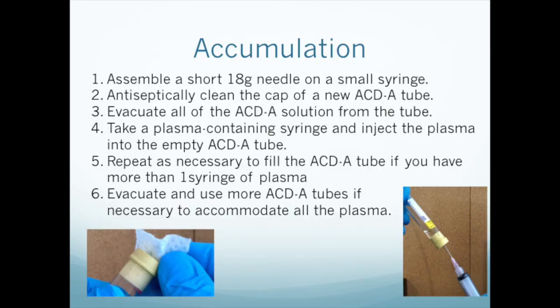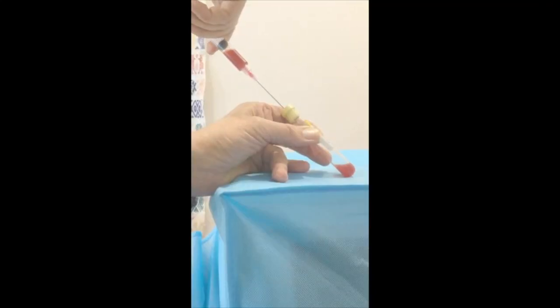Antiseptically clean the cap of a new empty ACDA tube. Assemble the 1-inch 18-gauge needle on a small syringe, then introduce the needle through the cap of the ACDA tube and withdraw all of the ACDA solution. Discard it. Now take the syringe full of plasma that you just obtained from the centrifuge tube and inject it into the new empty ACDA tube. If you have multiple ACDA tubes in the centrifuge, repeat the process with each one. You may have to empty more tubes of ACDA to create empty ones for the plasma, depending on how many you centrifuged.